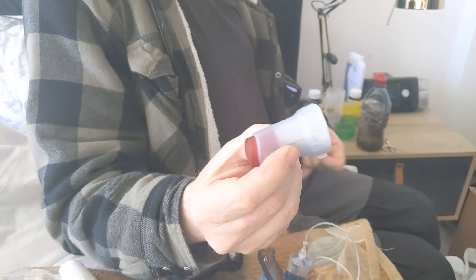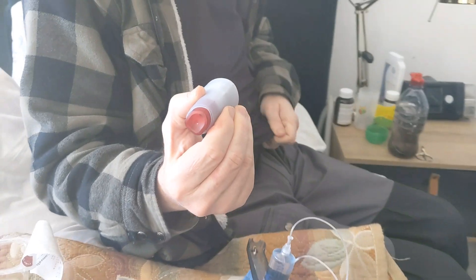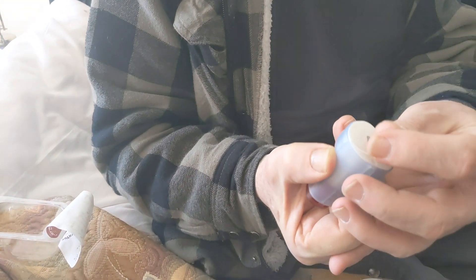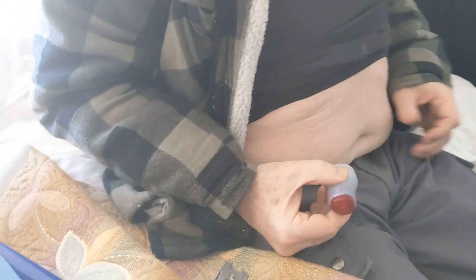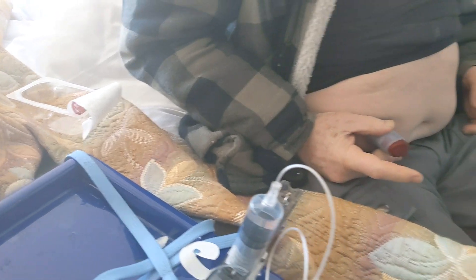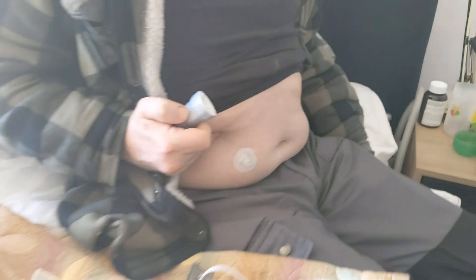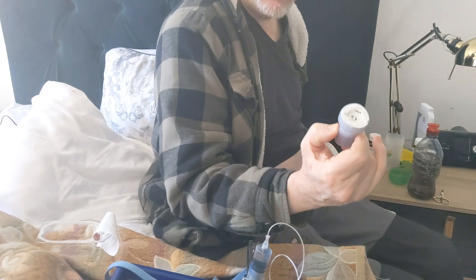Next I have to decide which side of the stomach to put this on, so I remove my shirt. I remember that yesterday the left side was used, so I have to turn this around and peel off the cover. Then this flat edge goes towards the belly button, and I squeeze the red button. This leaves the cannula embedded in my skin with the stomach fat behind it, so this part can now be thrown away.